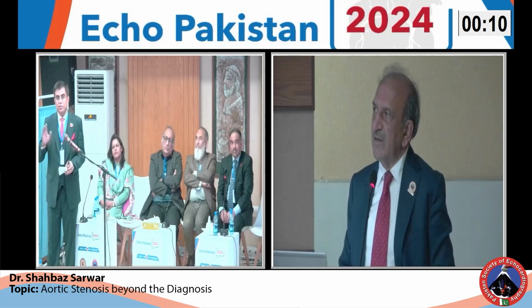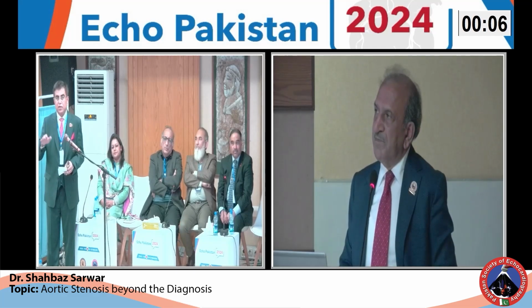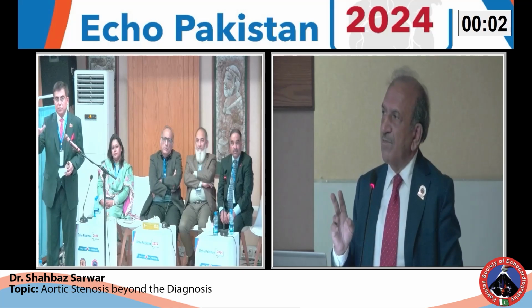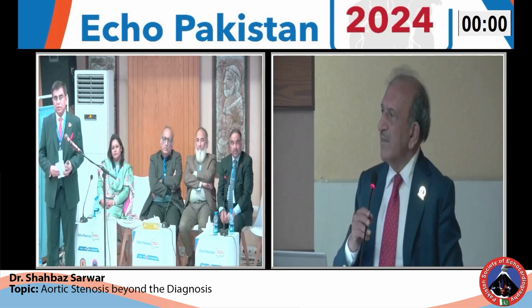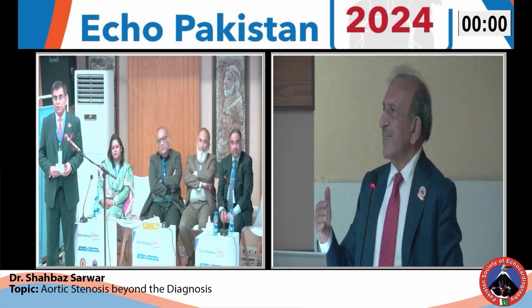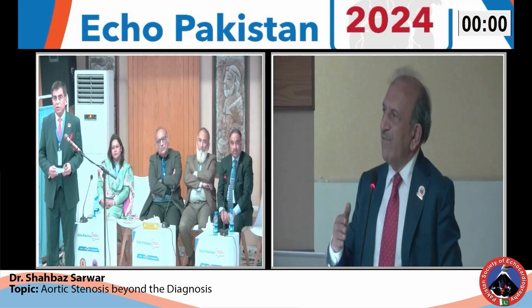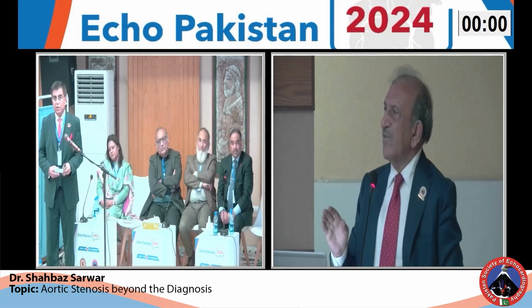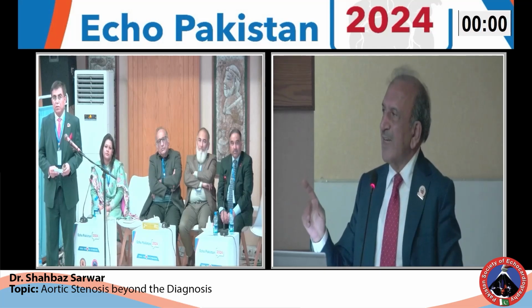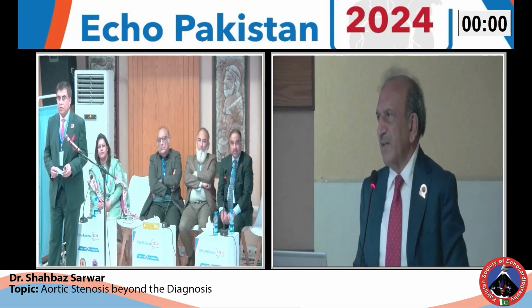So if the EF is above 60% and the GLS is less than 16, it is an indication for the surgery, and the patient is having borderline symptoms. Yes, in such kind of patients, you at least get one more modality, like a supplemental thing which is supporting your point, because otherwise this single thing is telling you that the myocardium is at risk. So just get support from the other thing as well.